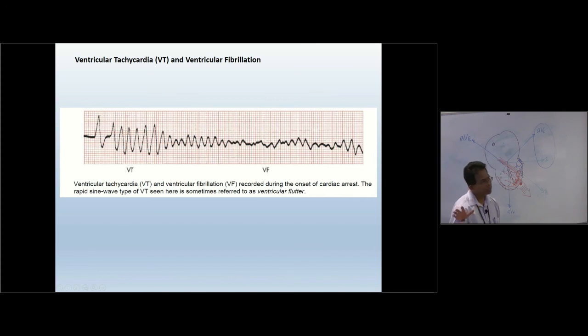Do you have any questions? I think this is the basic stuff Lisa discussed as well, and the ischemic heart disease component they will discuss in tomorrow's lecture. Then you will get a better understanding of how the ST segment changes, how it goes up and down as well.